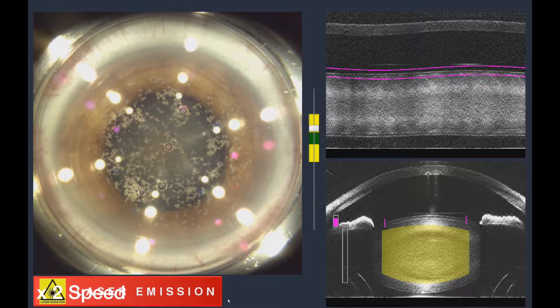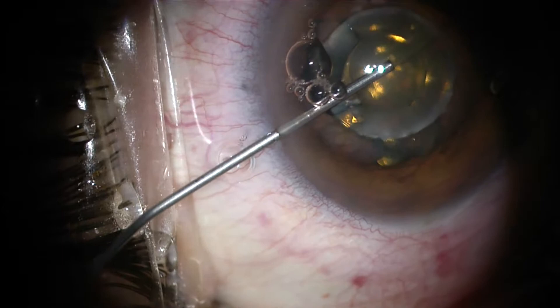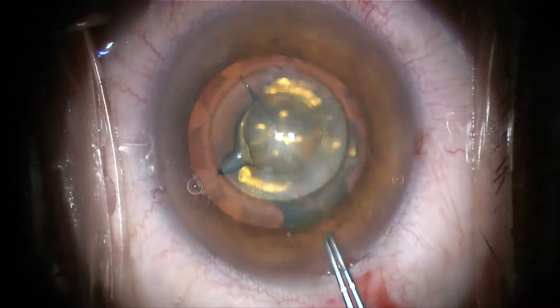That means that when I get to the operating theatre, I'll be spending less time inside the eye. I'm now injecting a viscoelastic and opening the wound through which most of the surgery will be performed. You can see that the anterior capsule can be removed without any further surgery because of the laser. In manual cataract surgery, that needs to be done by hand.